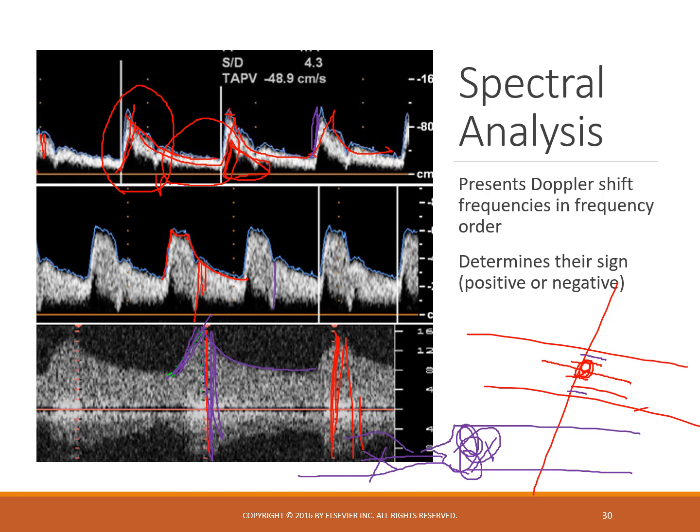Okay. So just some different terminology you're going to be thinking about. When I'm trying to teach ultrasound students about this, I'm always telling them, be the red blood cell. So when the heart squeezes, it's going to project you forward. When the heart stops squeezing, you get to slow down. If there's nothing ahead of you, you get to go ahead and continue slowly on your way forward.